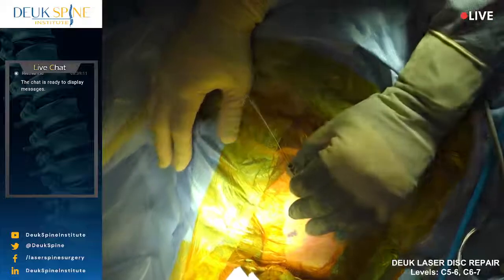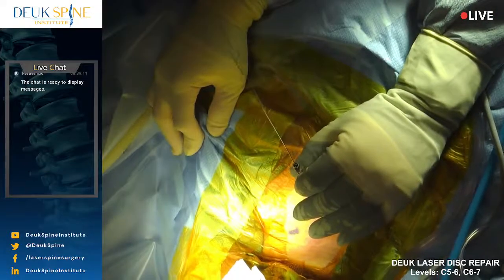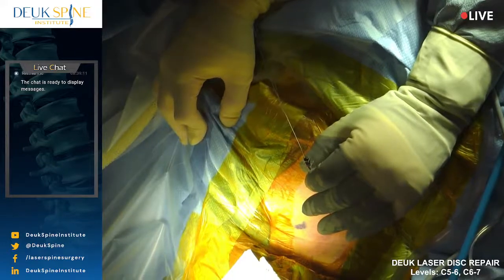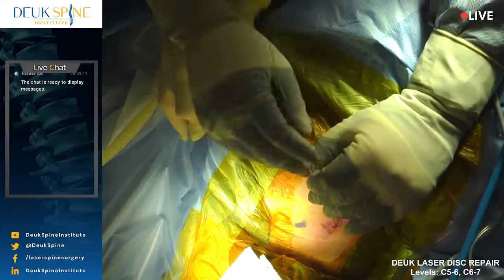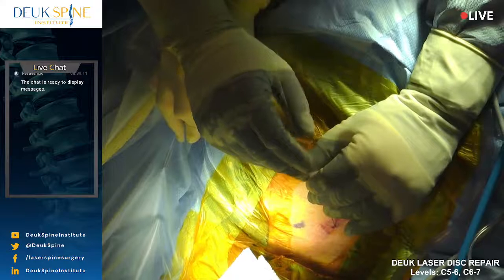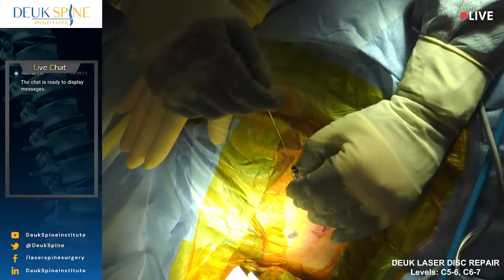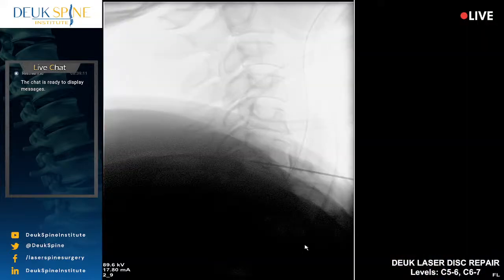I need a little bit more. Thank you. Pull a little harder. And perfect. That's good right there, everybody. Just hold. Relax. We got the picture we needed. So I'm using a lateral view to see exactly where we are in the disc.